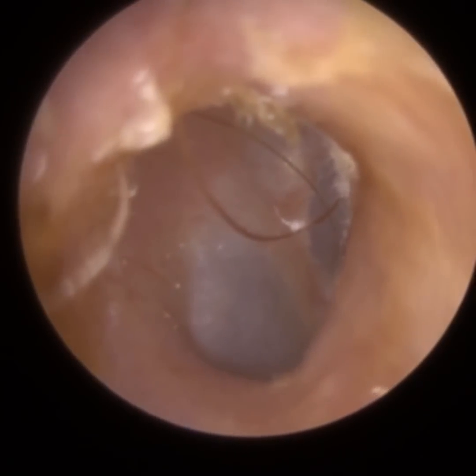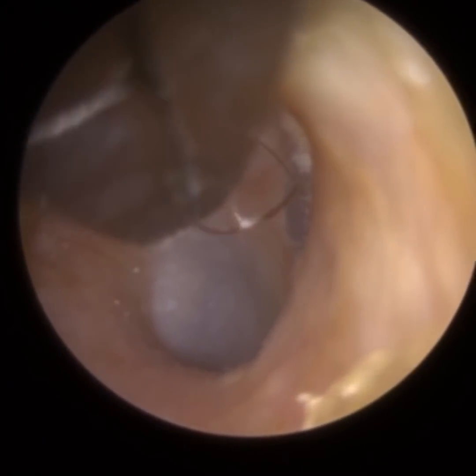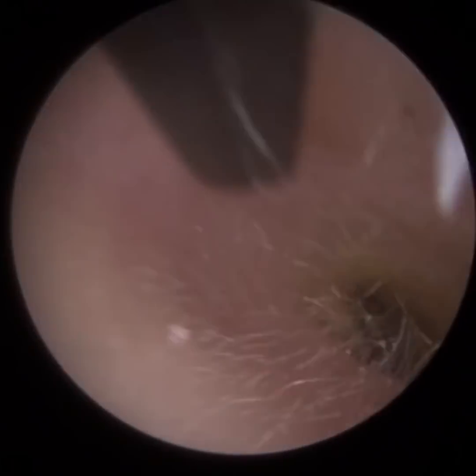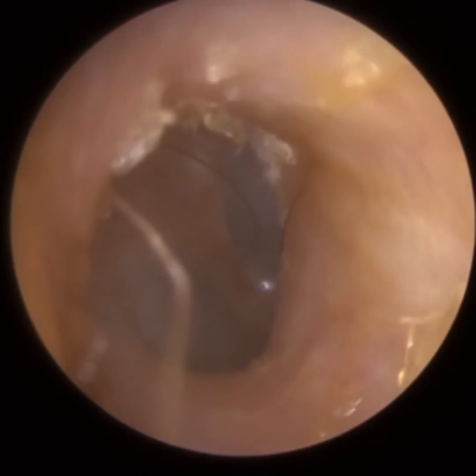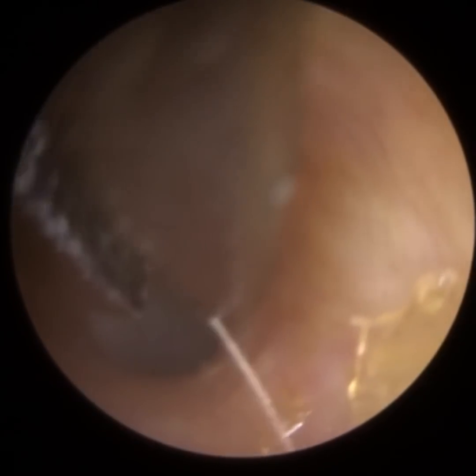But now there's a few loose hairs here. I'm going to just try and pinch these out using some forceps. Yeah, the patient actually felt this one. So this was actually attached to the canal wall. They felt it being pulled out, plucked. There's another one to the left. There is one left right near the eardrum.